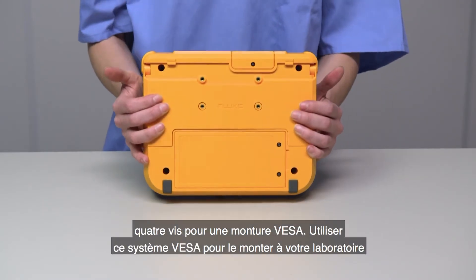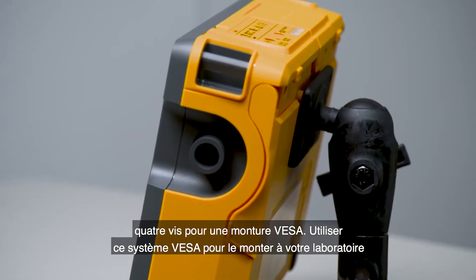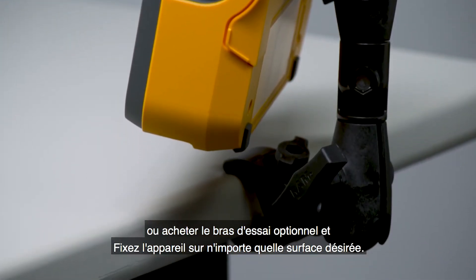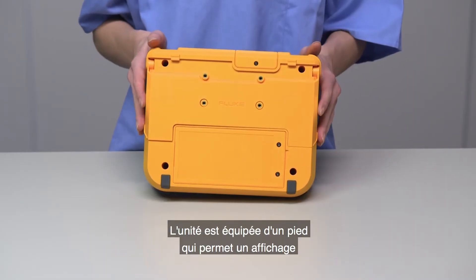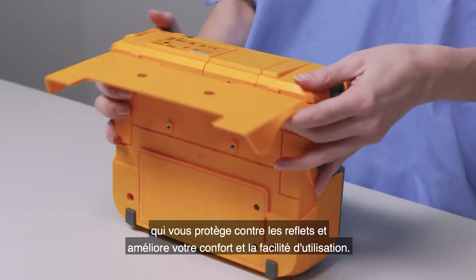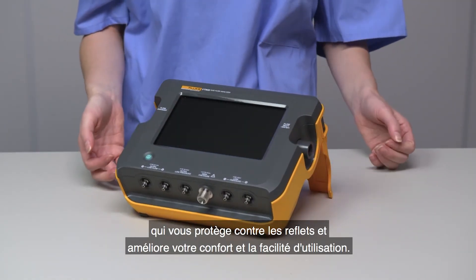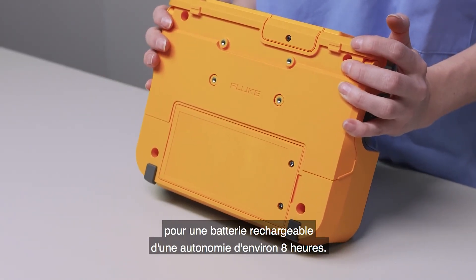On the back of the device are four screw holes for a VESA mount. Use this VESA system to mount it to your lab bench, or purchase the optional test arm and clamp the device to any surface you desire. The unit is equipped with a bail that allows for an alternate viewing angle to help protect from glares and for your comfort and ease of use. This is the battery compartment for a rechargeable battery that lasts about eight hours.